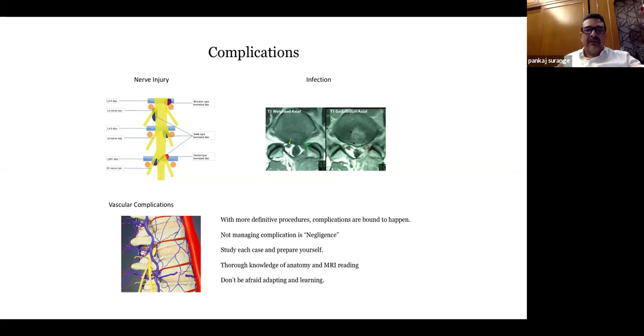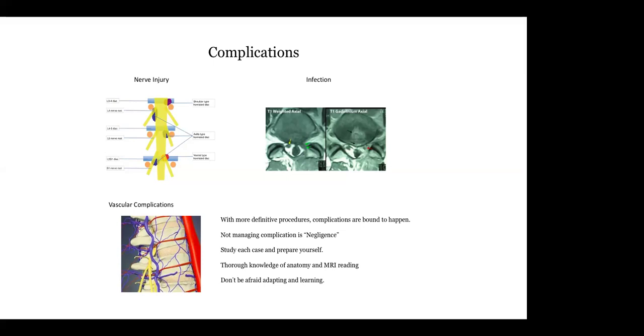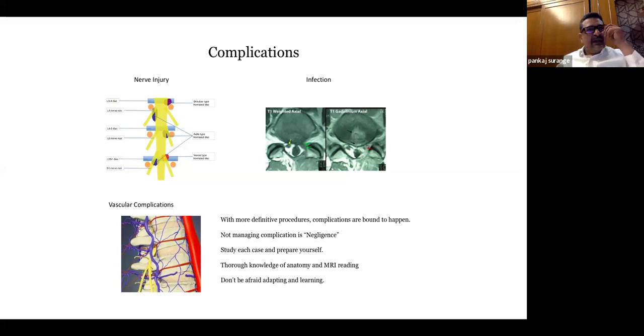I think somebody is mentioning the iliac crest, right? Yes, sir, the transiliac approach. Yes, that is again one of the approaches. But let me tell you, this approach is not a very good approach because it is very painful and very complicated also. Better to learn the interlaminar. L5S1 interlaminar is the best. You can see everything in front of you. You can do proper decompression. You can see the nerve root. You can see the dura breathing properly.